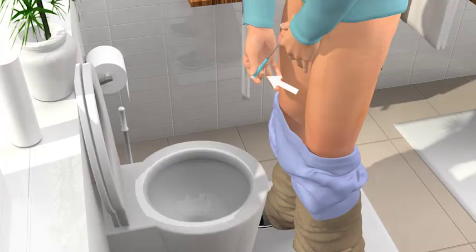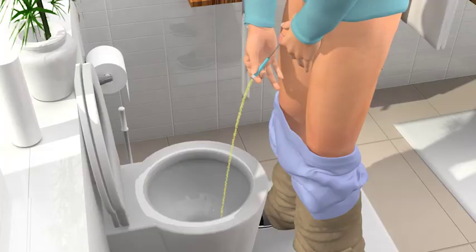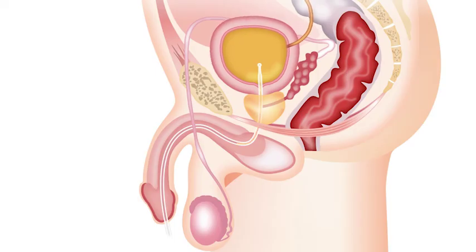If needed, push the insertion grip all the way back onto the connector to be able to use the full length of the catheter. Make sure that the connector is pointing towards the toilet before the urine starts to flow. Some prefer to hold their thumb over the connector or to bend the catheter to hold the urine back until they are ready to drain it into the toilet. Continue to insert the catheter until it reaches your bladder and urine starts to flow. Then continue for a few centimeters further.